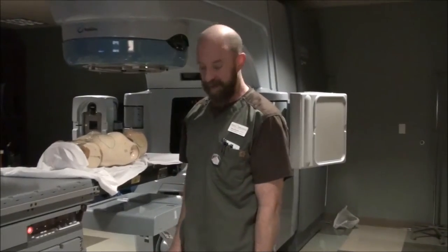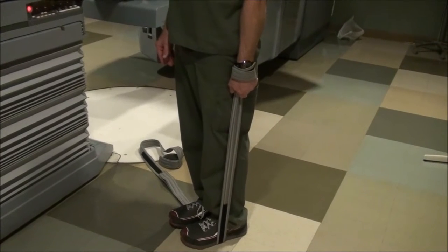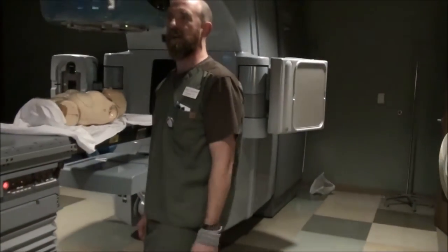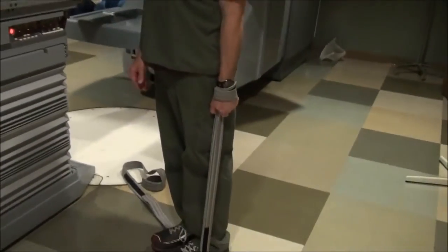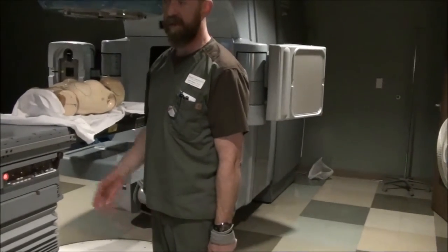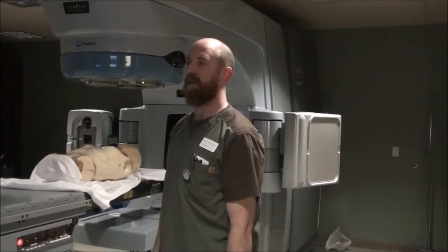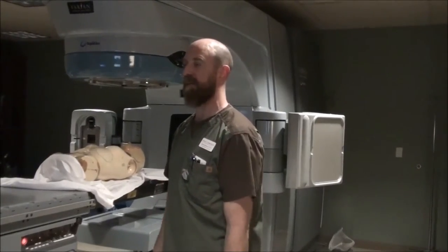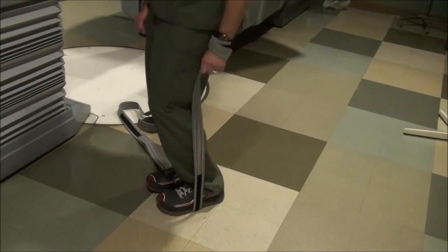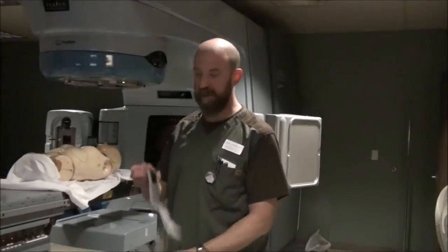You want to have the legs flat. If the legs aren't flat — let's say you have a knee rest — their knees are going to be bent and they'll just relax their knees and this is going to be loose. You want this tight and you want it to be exactly the same all the way through the course of simulation and treatment. So having the knees straight, holding pressure on the shoulder and on the wrist — but not painful — is what you actually want.